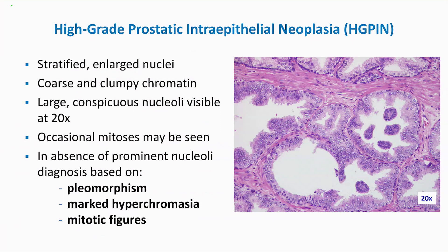Here is an example of high-grade prostatic intraepithelial neoplasia. There is stratification of the nuclei, nuclear enlargement, and a more coarse, clumped chromatin pattern. Nucleoli are usually visible at 20x magnification, and this is one of the criteria I use to make a diagnosis of high-grade PIN — probably one of the most common criteria used by most genitourinary pathologists. Occasional mitoses may also be seen, and a diagnosis can be made in the absence of prominent nucleoli if nuclear pleomorphism, marked hyperchromasia, and mitotic figures are present.